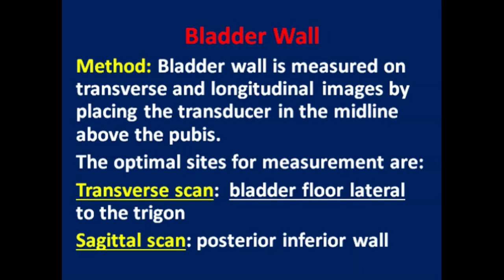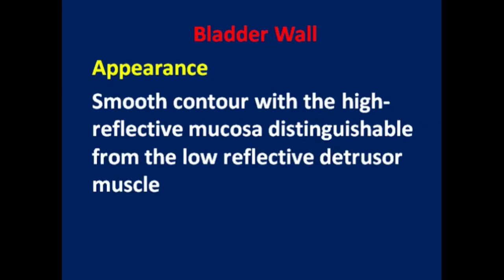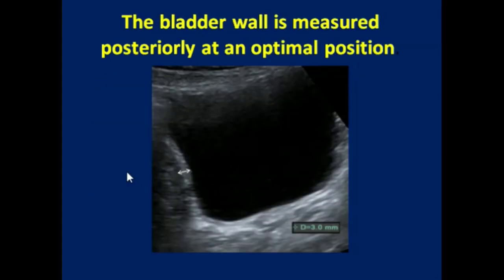By placing the transducer in the midline above the pubis, the optimal sites for measurements are the transverse scan of the bladder floor lateral to the trigone, and the sagittal scan of the posterior inferior wall. The smooth contour with high reflective mucosa is distinguishable from the low reflective detrusor muscle.